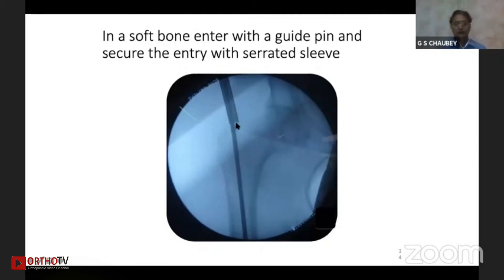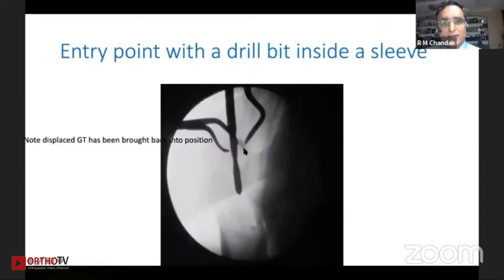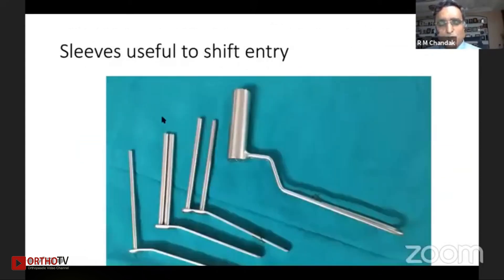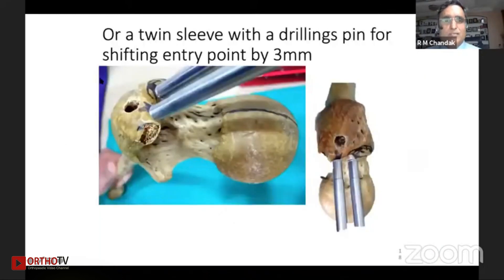A serrated sleeve on the drill can make the entry point secure so that we can exchange the drilling feed with the guide wire. As you can see here, this is the drilling sleeve — the drill has penetrated and the sleeve is inserted on the drill point so that the area is secured. If you want to change the entry point a bit, a honeycomb targeter helps a lot, giving the precise entry point for a PFN. These sleeves allow shifting of the entry point by three millimeters or six millimeters.